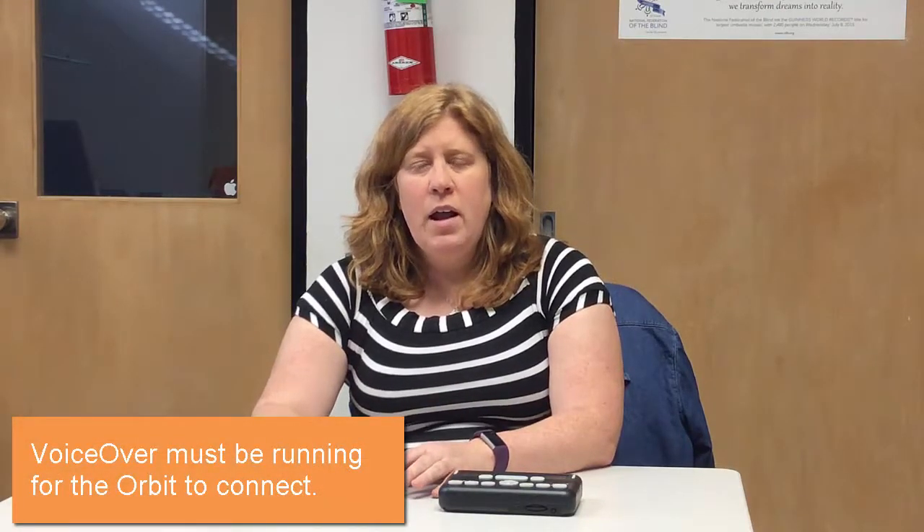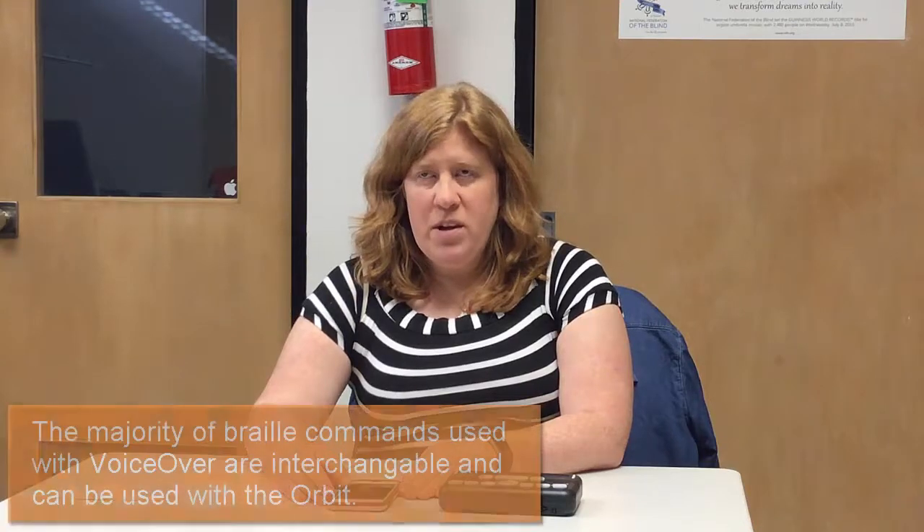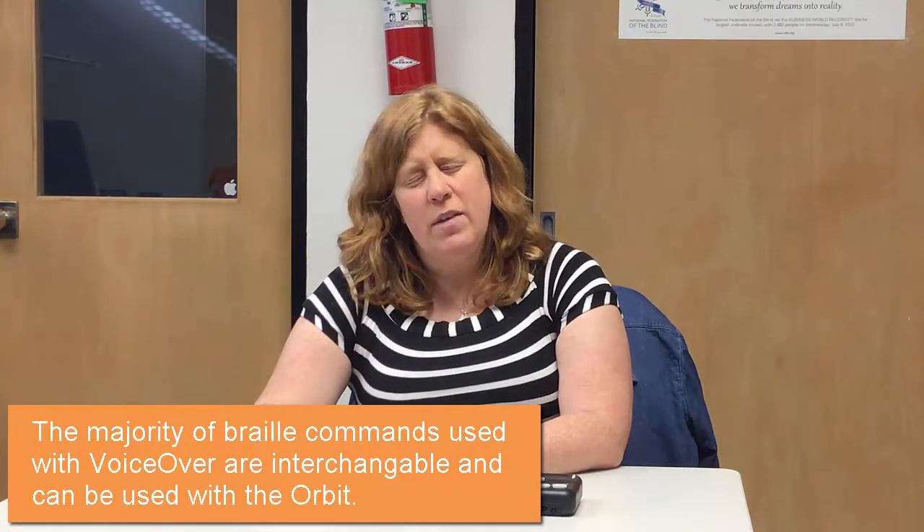So what we're going to do first is talk a little bit about why we're going to do things the way we're going to do them. The phone itself is sort of the brains behind the operation. The display is just sort of the means. So because the main device we're using is the phone, it has to have the screen reader turned on, which is VoiceOver, and Bluetooth has to be enabled. But the other thing to tell you is that for the most part, all commands that work on other Braille displays will work on the Orbit because, again, the brains behind the operation is the iPhone, not the Orbit.